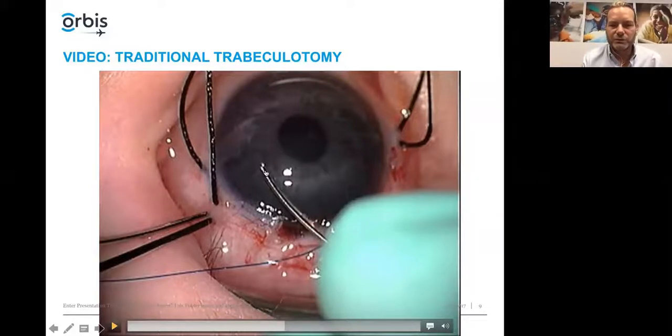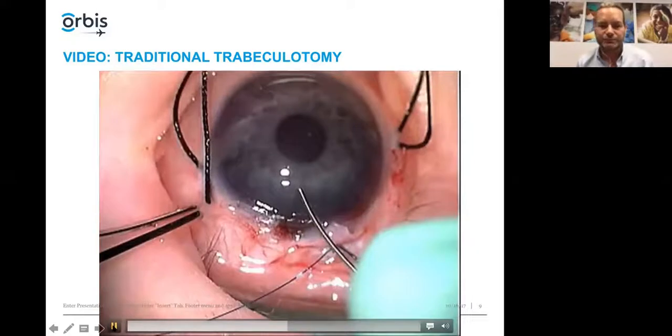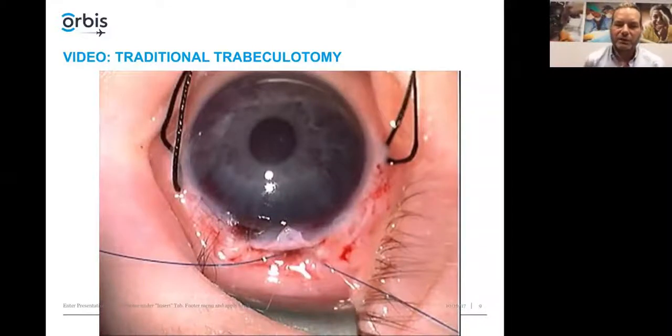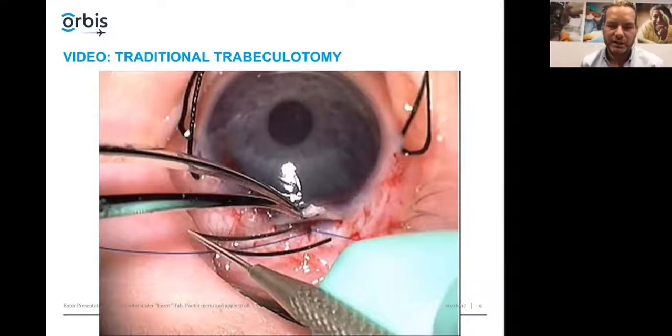What I don't do is keep that trabeculotome going out over here. I don't want to get over the pupil. But also I don't want to completely tear out this middle part of the meshwork yet, because that'll cause the anterior chamber to shallow and we still have another half to do here. So I rotate it partially and then I withdraw it. And now I'm going to go back to the right side here and do the same thing with the trabeculotome there.